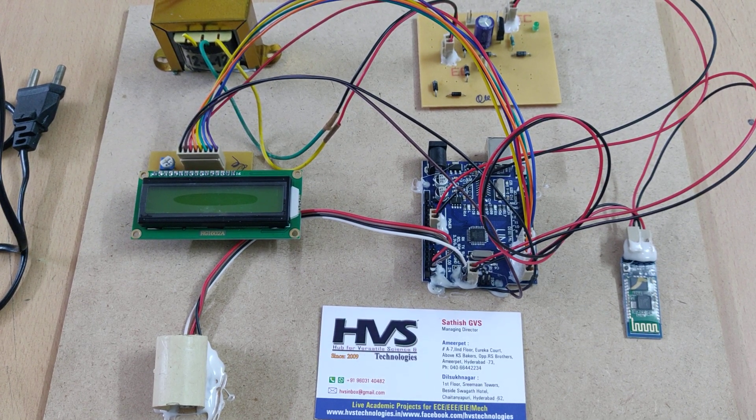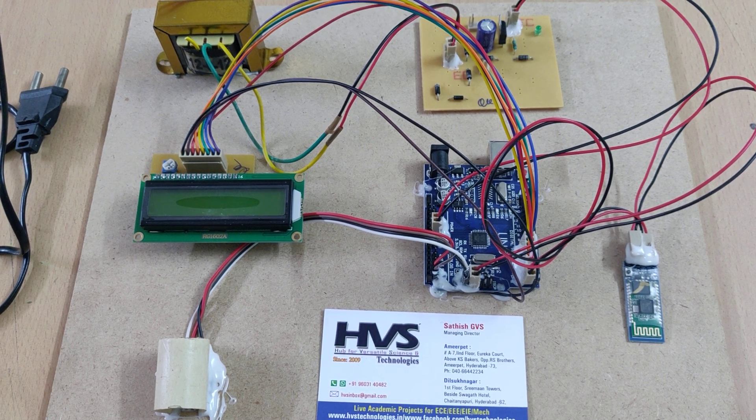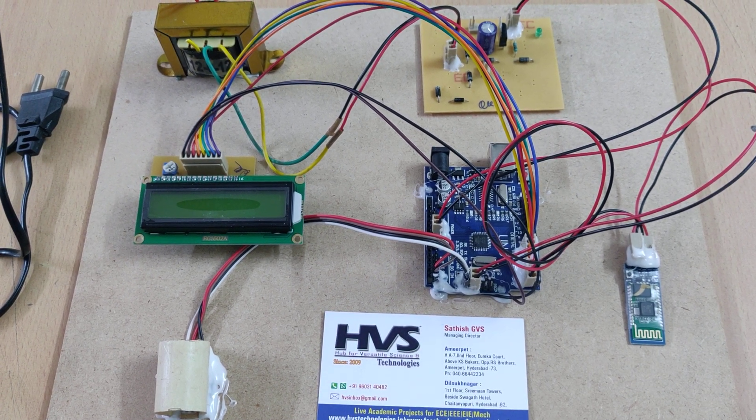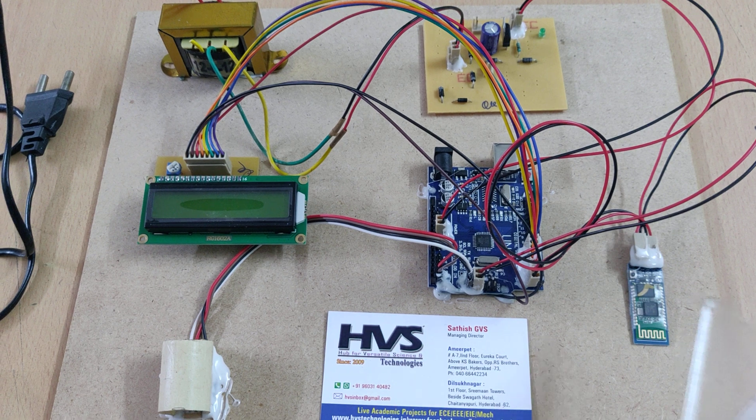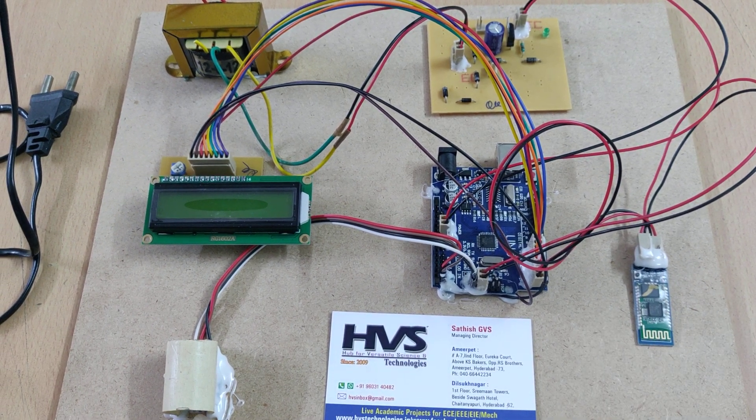Welcome to the positive demonstration of a non-invasive glucometer that sends data to a mobile phone. Here we are going to send the data to the mobile phone through the HC-05 Bluetooth module.